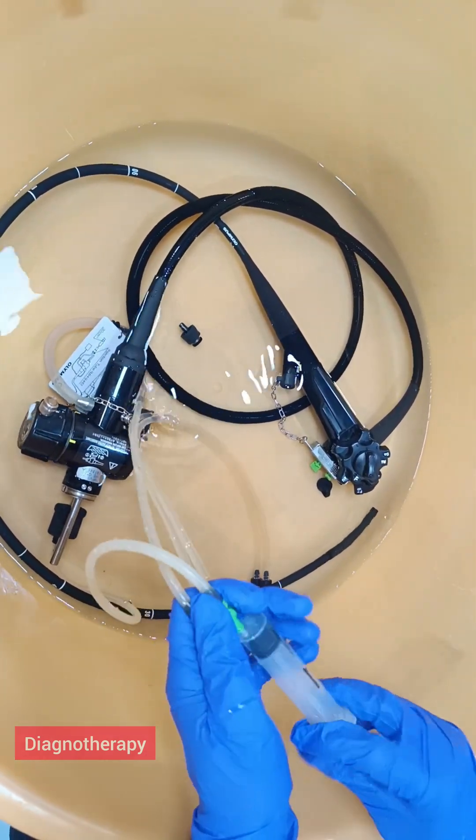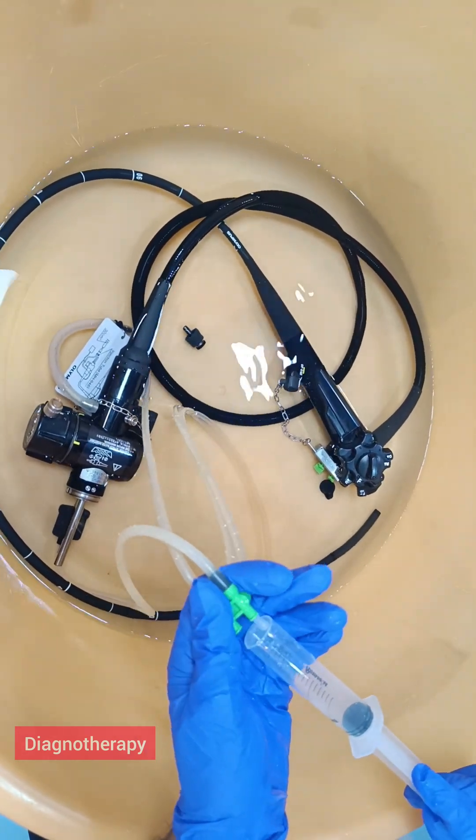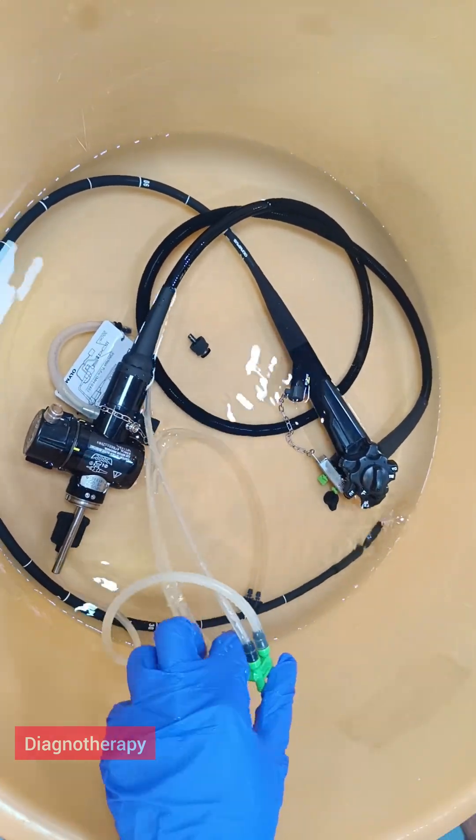After sucking and flushing we need to just flush the air. You can see we are flushing the tube with air.